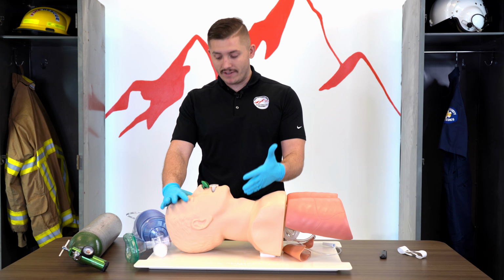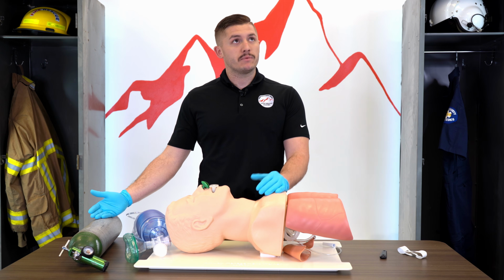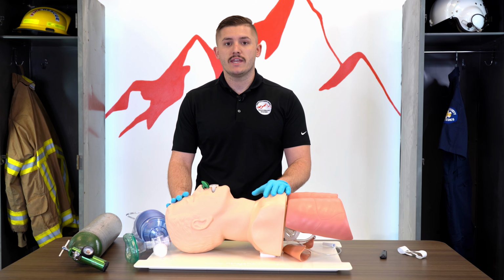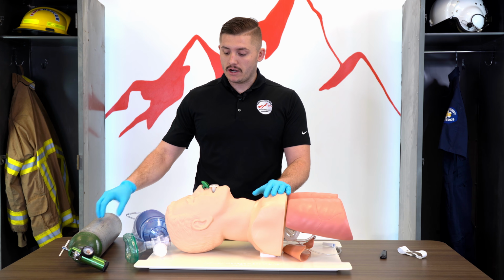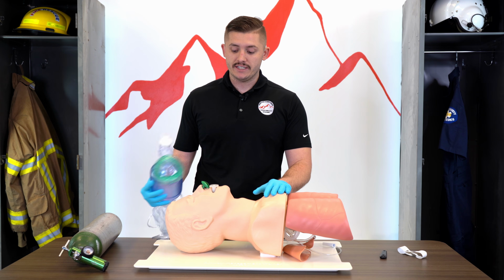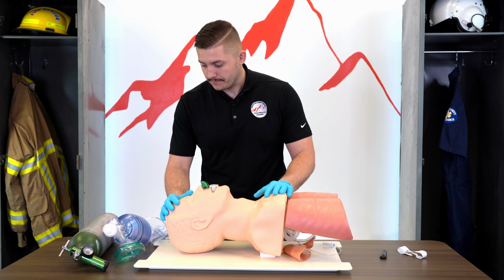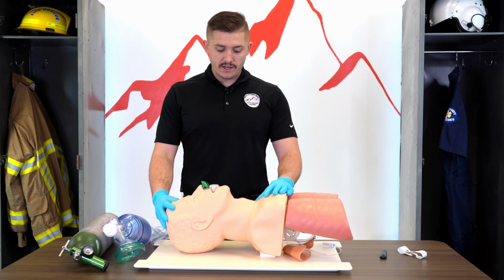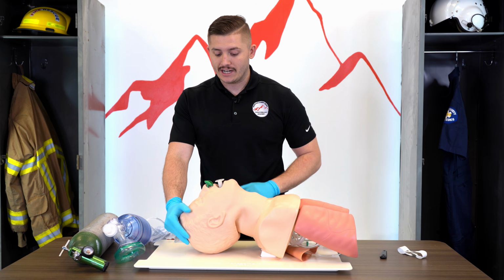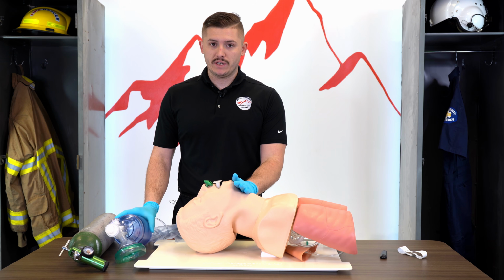Same science though, if I ventilate them without attaching them to oxygen, I'm giving them atmospheric air, and this patient needs a lot more than that, right? So we're going to place them on oxygen, and we're actually going to use a BVM to ventilate the patient instead of just oxygenate them with a nasal cannula or a non-rebreather. So getting into the BVM, right? We've opened our patient's airway, we've suctioned, we've placed our adjuncts, our airway is maintained, and now we need to start ventilating.